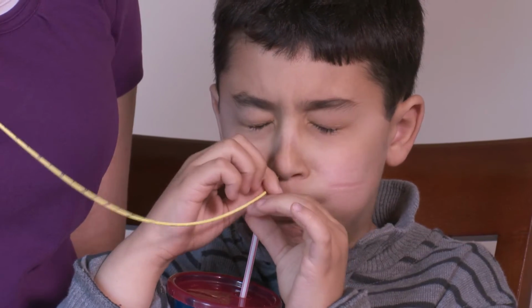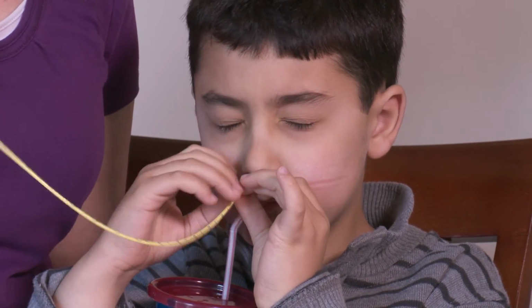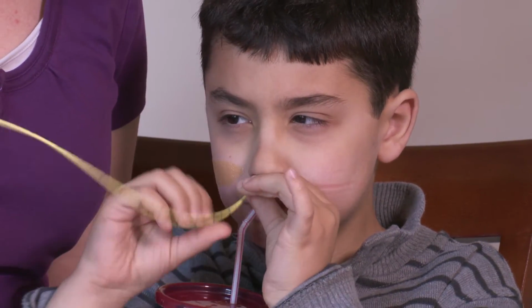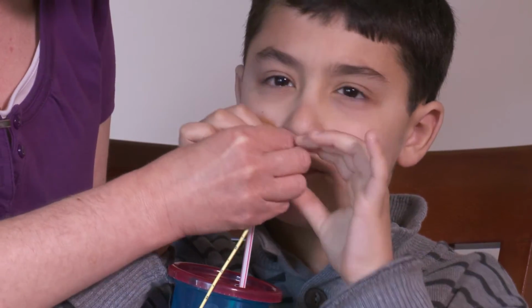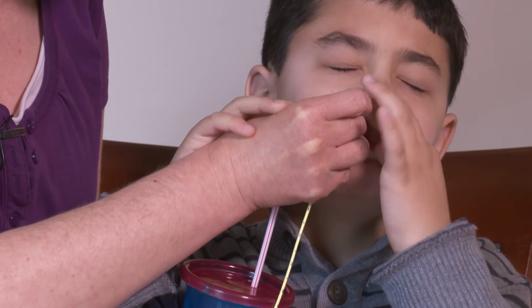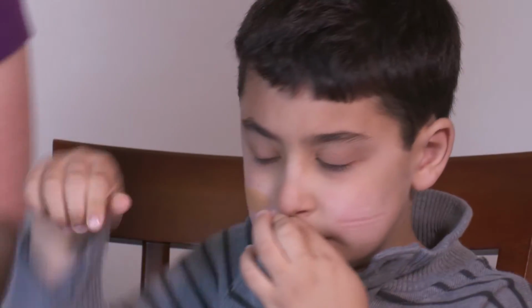Okay. Now once you get it going, keep going. Swallow, swallow. Drink, drink, drink. Swallow, swallow, swallow. Just a little bit further, bud. Like a half centimeter. There you go. Good. Wait right there. Here's my stethoscope.